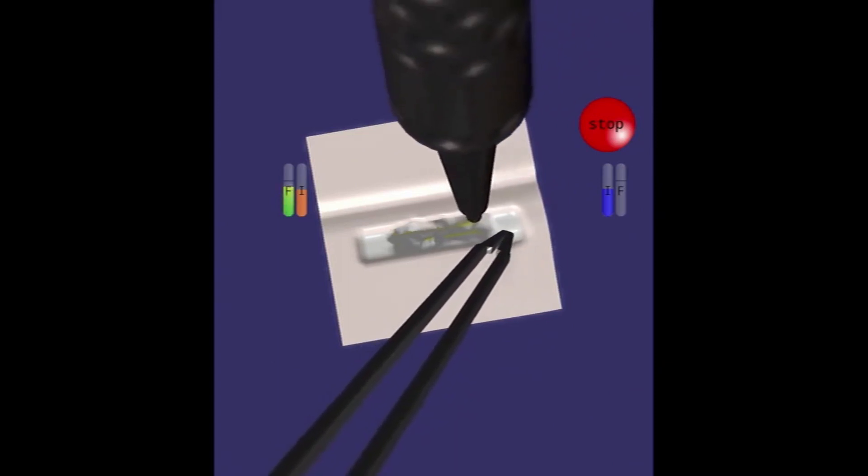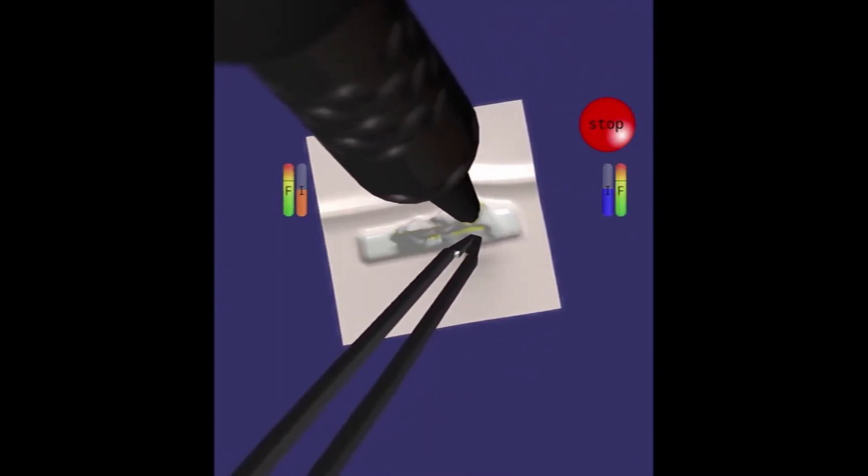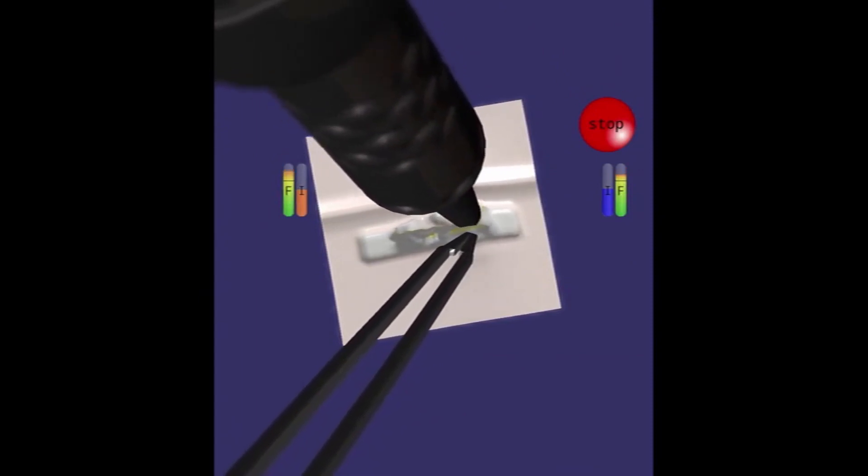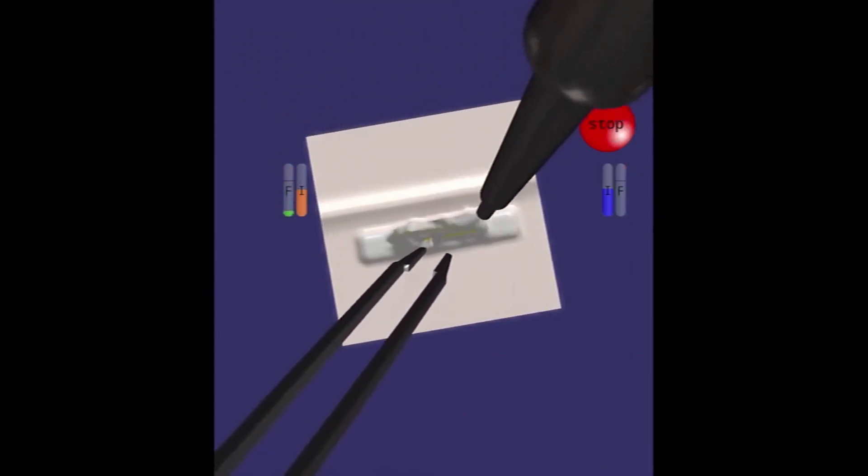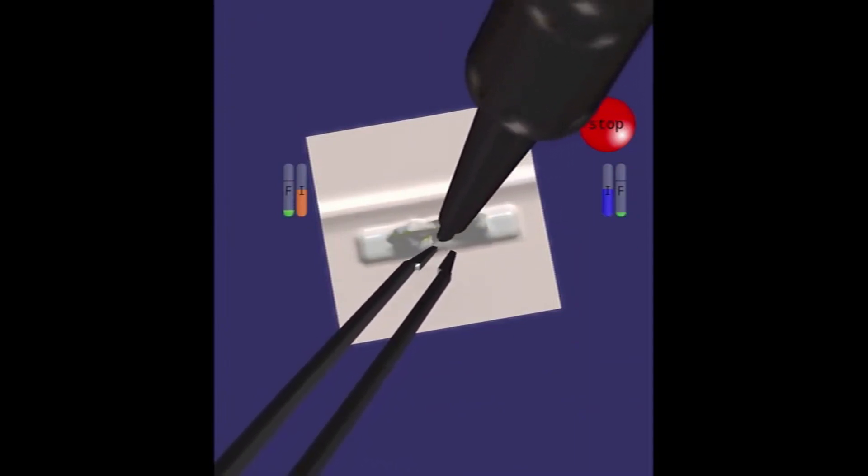Upon damage to the blood vessel, the suctioning sound of the aspirator is heard and if injury to this vessel is severe, bleeding will be observed. This participant avoids further injury to the vessel by being gentle near this structure.